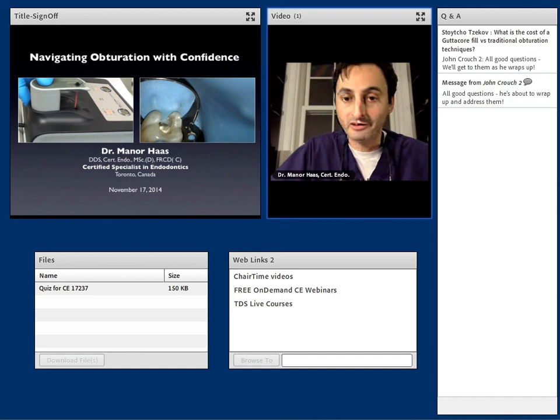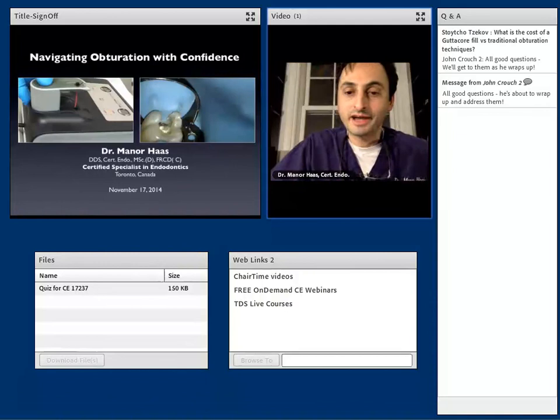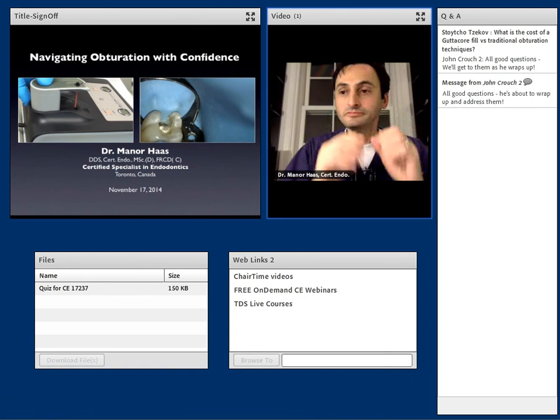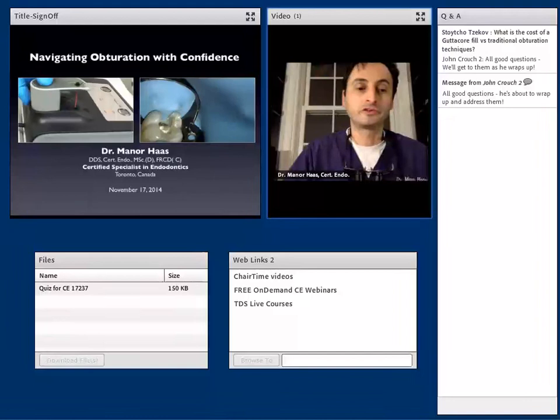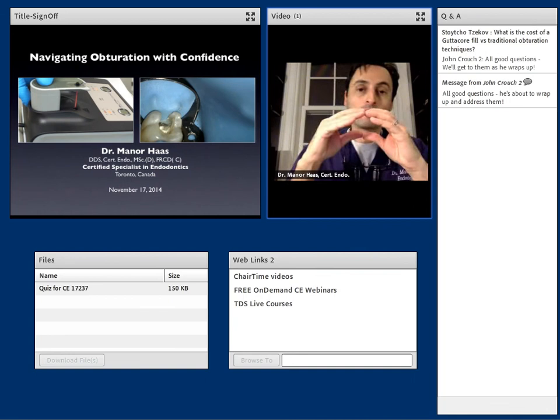And Tyler was, I just opened Tyler's question. How do you manage canals that join together apically? So I think I just answered that one. Another question he had was, how do you manage canals that have sort of a figure eight configuration? In a case like that, and I only have so much time tonight, if you have a figure eight obturation or an ovoid even, what I personally like to do is, for argument's sake, let's say I use a red Wave One, and I use that in that ovoid canal, and I go back and forth and brush the walls.